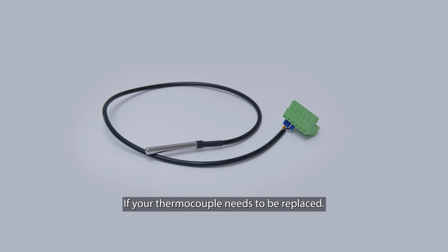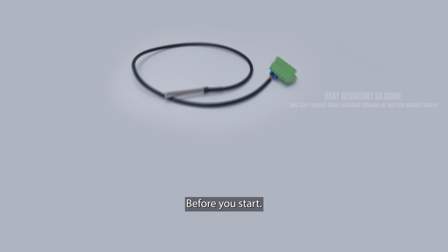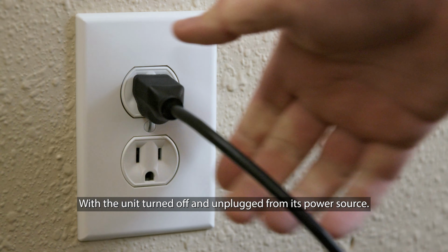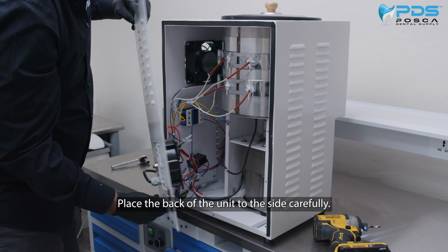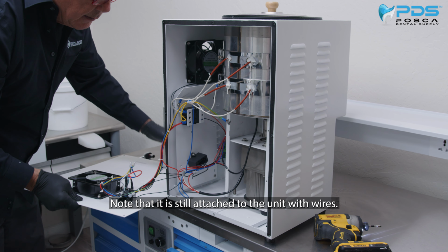If your thermocouple needs to be replaced, please follow the following instructions. Before you start, ensure you have the tools and necessary parts. With the unit turned off and unplugged from its power source, remove the back of the unit. Place the back of the unit to the side carefully. Note that it is still attached to the unit with wires. Be mindful.